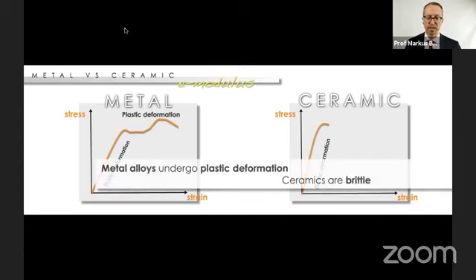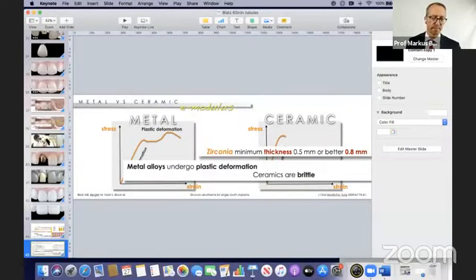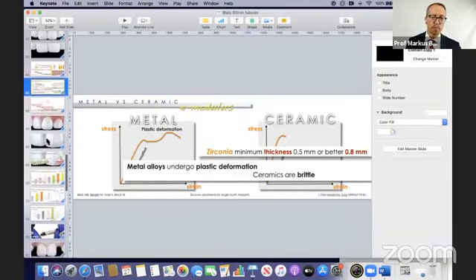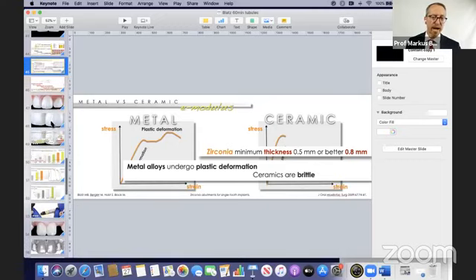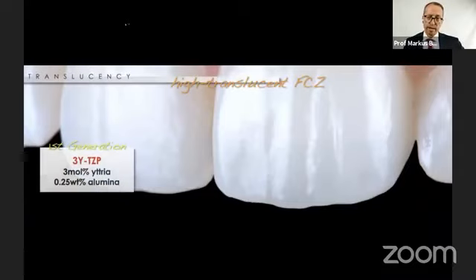So I have to be very careful and understand that based on the strength of the ceramic, it needs a certain thickness. We need to keep that in mind, specifically when we talk about the newer ceramics and newer zirconias that we have available today. There are different generations of zirconia available right now. The first generation was more opaque, and was the strongest, though, with about 1,200 to 1,500 megapascal. But it was more opaque because of the alumina content.